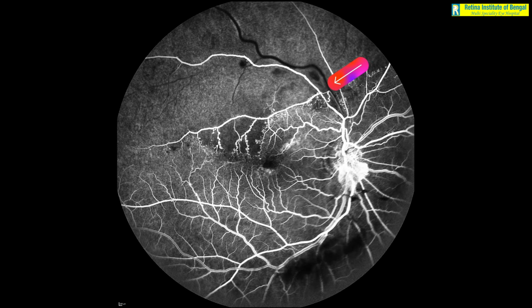Yeah, so you can see now this vein is more or less filled. There is some laminar flow still here, but most of these veins are completely filled with dye, but still no dye in these vessels. This means that the flow is delayed in the superior half of the retina.